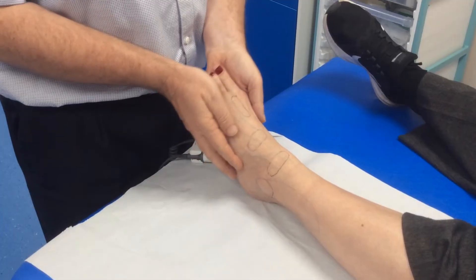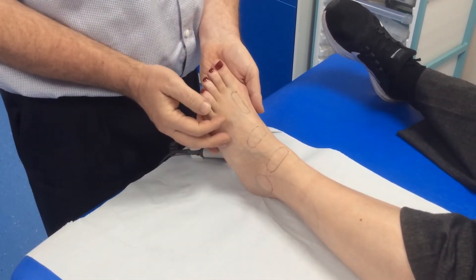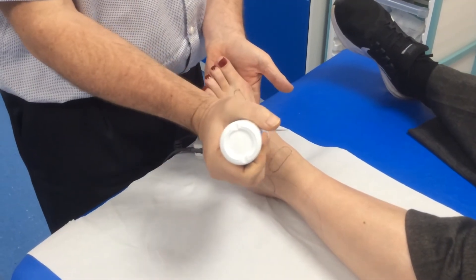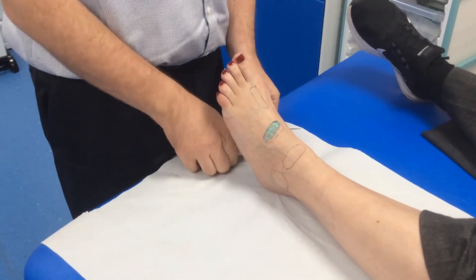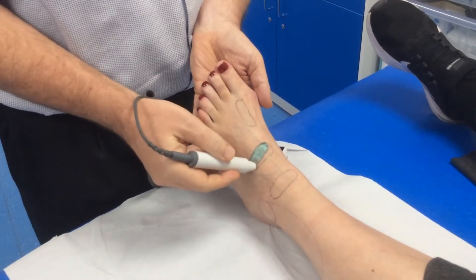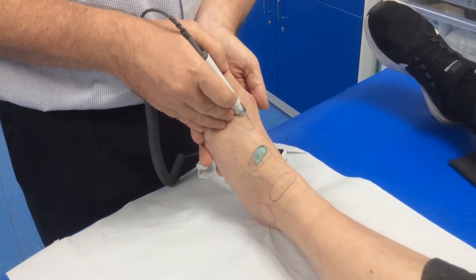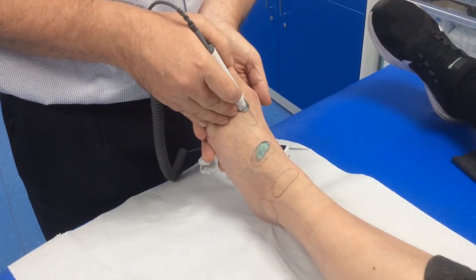I'd ask the patient to relax their foot so that the tissues aren't too stressed. I dorsiflex it slightly and then I'll use some ultrasound gel and put some on the foot. Next I'm going to turn on my Doppler, getting some gel on the probe end, and listen in this area between the first and second metatarsal bones.